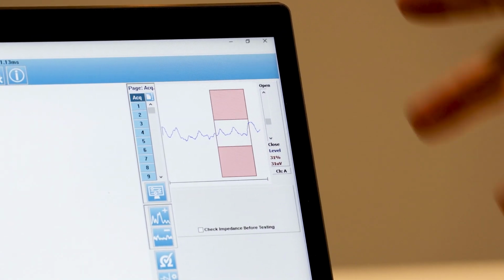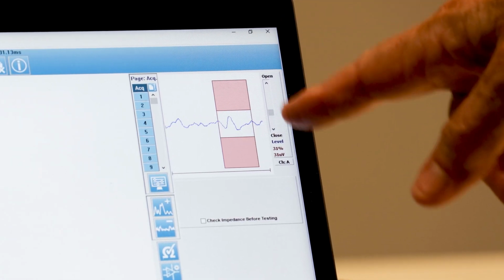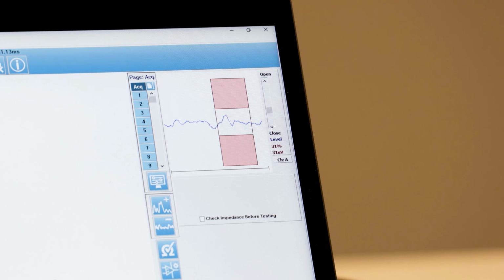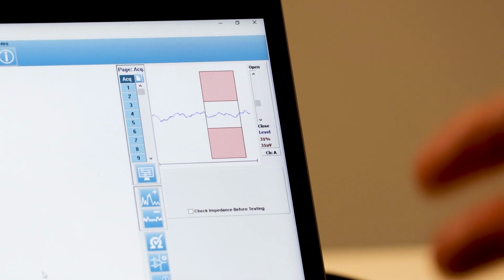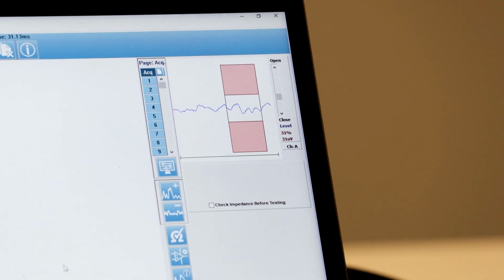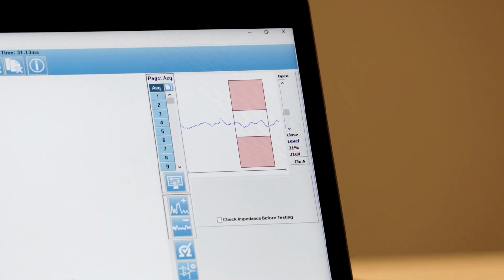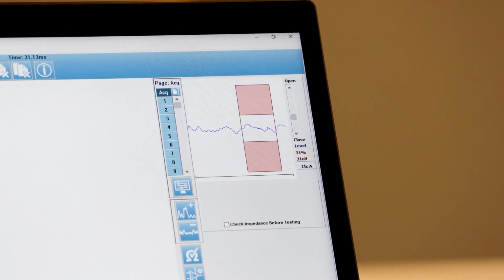Because the jaw muscles are being contracted, we're picking up all of the electrical activity from the muscle. And that is going to wreak havoc on our ability to do this test. So if something like that was the dominant aspect of the recording, then we'd have to figure out where that was coming from, because we really wouldn't be able to obtain a good recording if that were the case. But now you can see we're back down there. There's another one that came through, and every once in a while, not super quiet, but it's still acceptable.